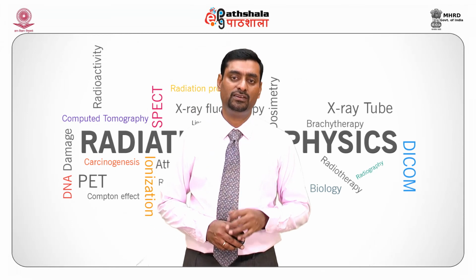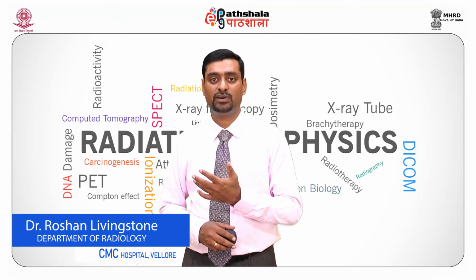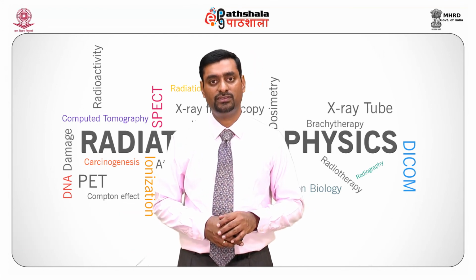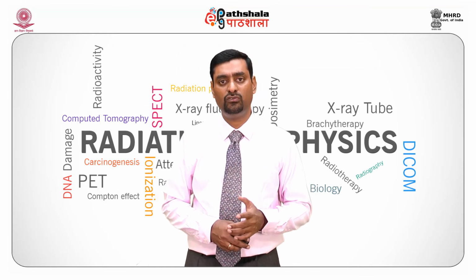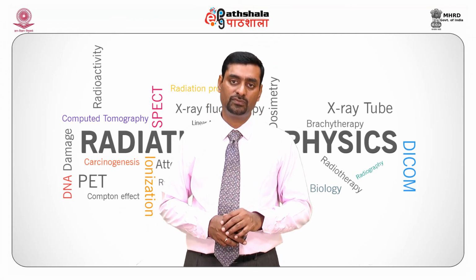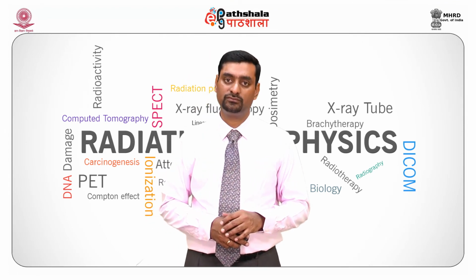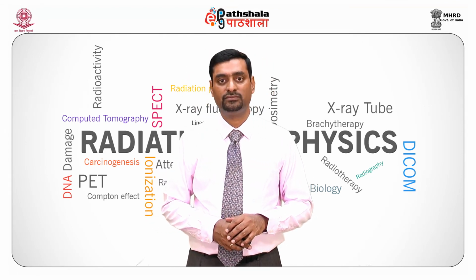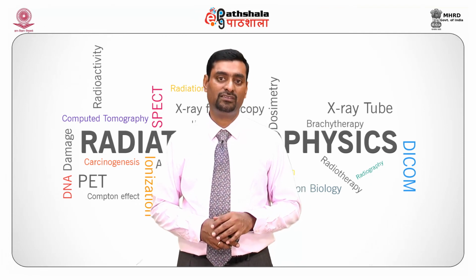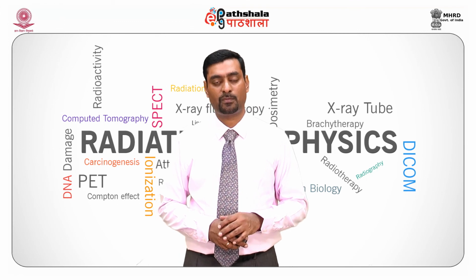And finally, the film, which is the detector, is ready for visualizing by the clinician. I hope you understood this module on how films are constructed, the cassette, intensifying screen and the processing cycle. To be more precise, in a processing cycle we have developing, then rinsing, fixing, washing and drying.